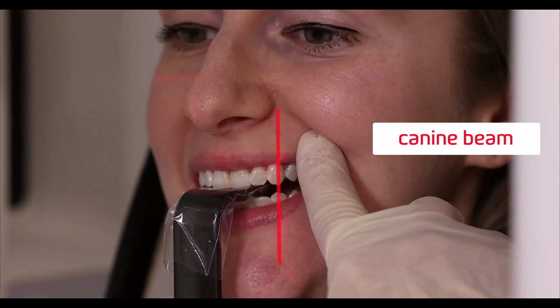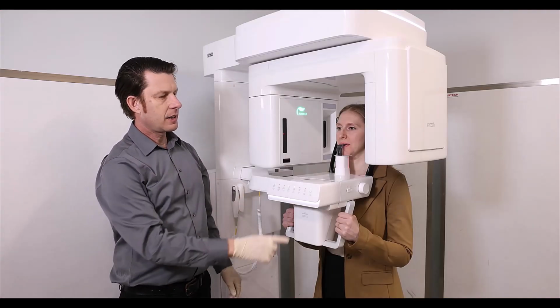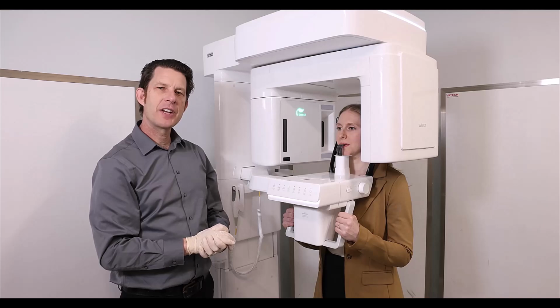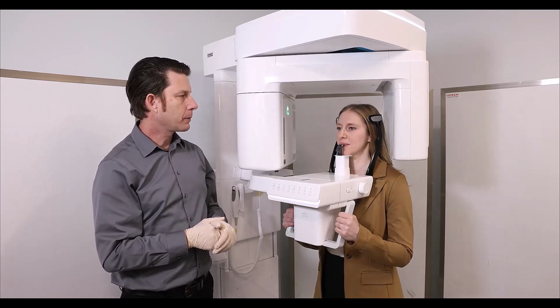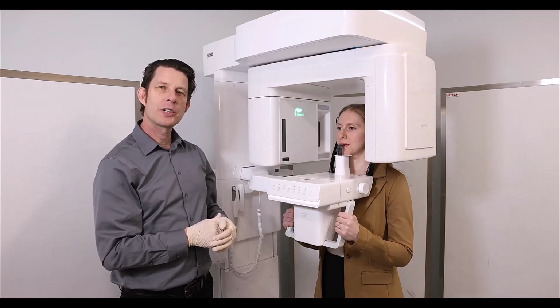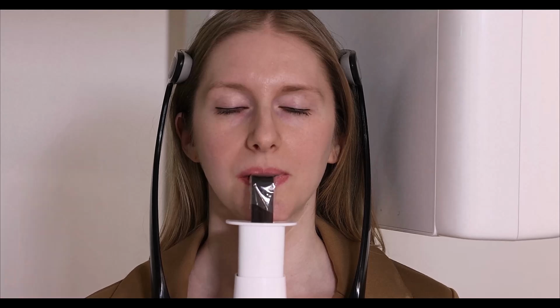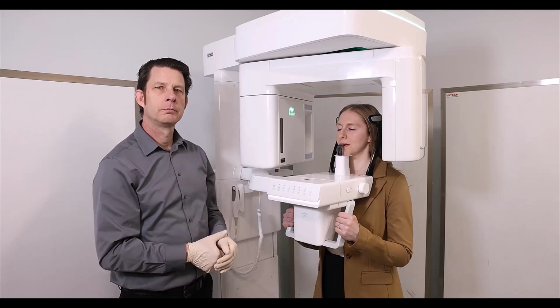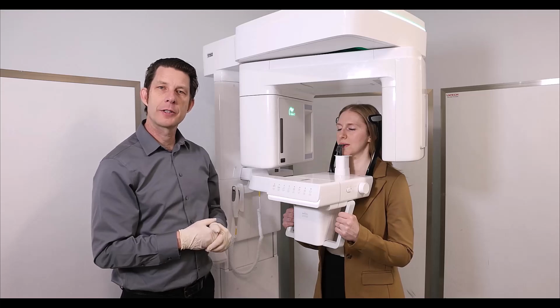Once I have the patient positioned, I'm going to go ahead and select the Ready Return button here. The system is moving into image capturing position. Please wait. I'm going to then have the patient close their lips around the bite stick. Go ahead and swallow and keep the tongue flat to the roof of your mouth. I'm going to have them close their eyes. You'll note that the machine will also tell them to close their eyes. The system is ready to capture an image. Please close your eyes until image capturing is complete. I'm going to go ahead and step out of the room and take our image.